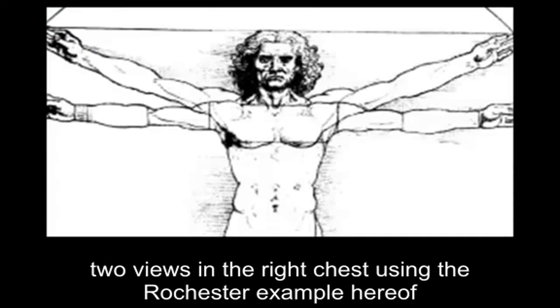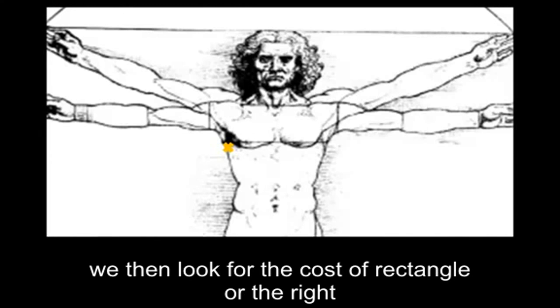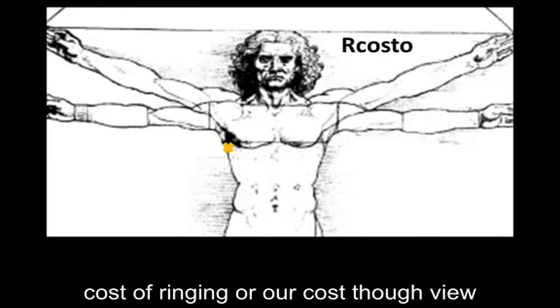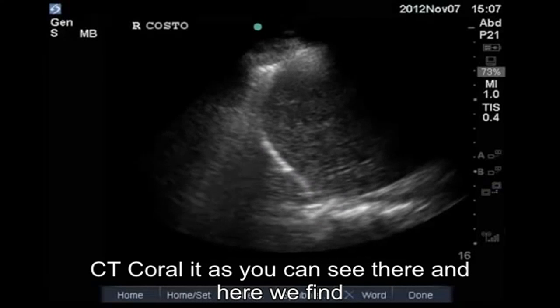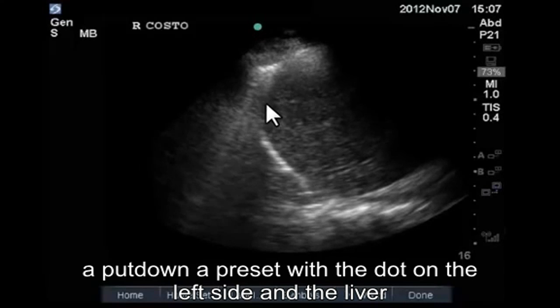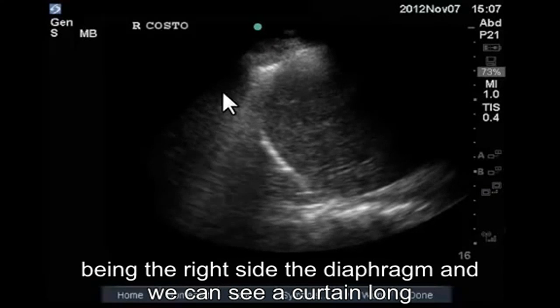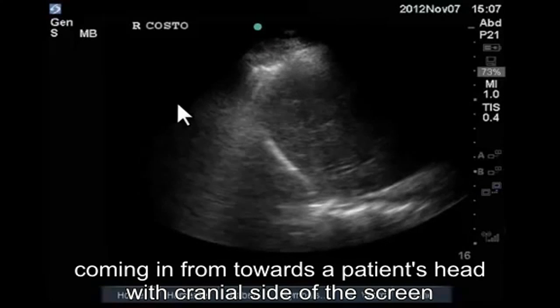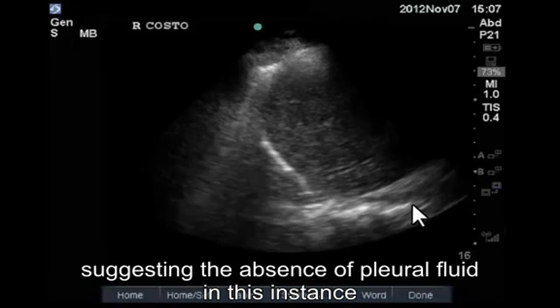So now that's the two views in the right chest, using the right chest as our example here of lung ultrasound. Moving on to the pleural assessment, we would then look for the costophrenic angle, or the right costophrenic angle, or R costo view, and the CT correlate, as you can see there. And here we find an abdominal preset with the dot on the left side, and the liver being the right side, the diaphragm, and we can see a curtaining lung coming in from towards the patient's head or the cranial side of the screen, suggesting the absence of pleural fluid in this instance.